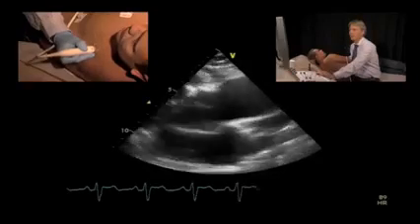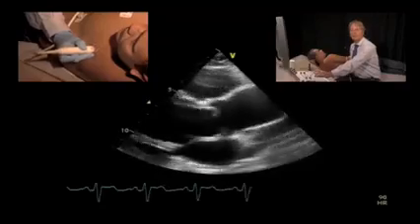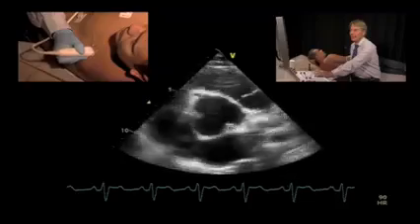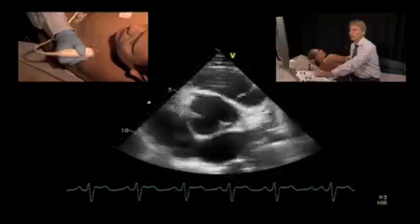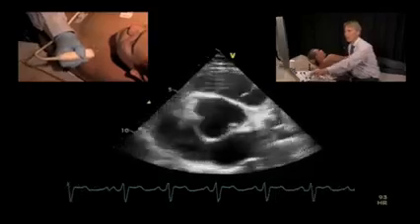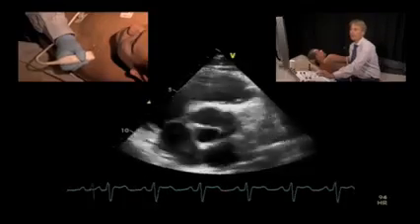And in addition, the ascending aorta is also dilated. So this together with the morphology of the valve is almost indicative of a bicuspid aortic valve. And we can exactly see the morphology of the valve here in the short axis view, and it's clear that the patient only has 2 cusps as opposed to 3. But we also note that the valve opens quite nicely, and we do not have the impression that the valve is stenotic.